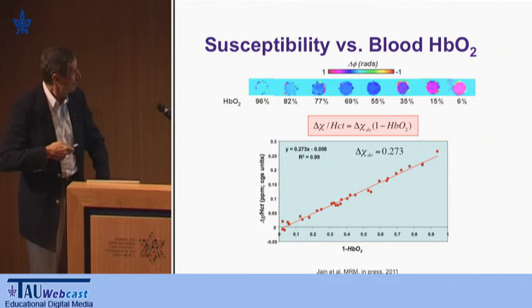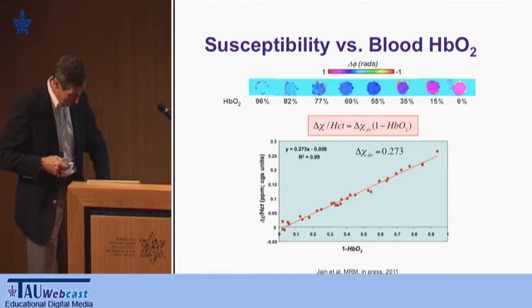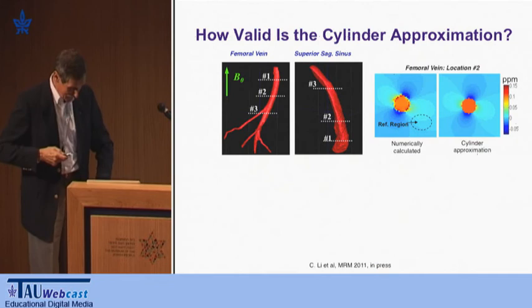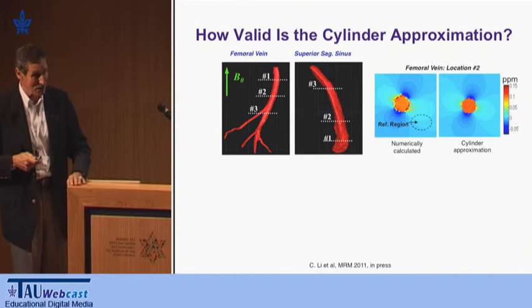We obtain this quantity. You can see if we extrapolate it to zero, then there's a slight offset, and that offset is real, which indicates that this was ex vivo blood. I should say these experiments have to be done extremely carefully, because blood is a juice that is not particularly stable.